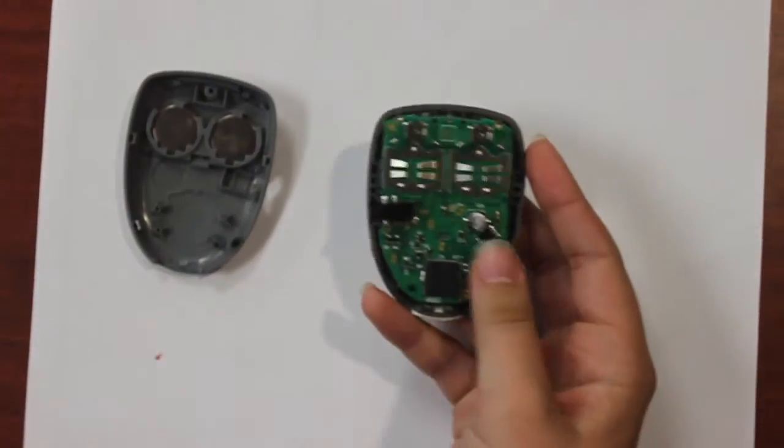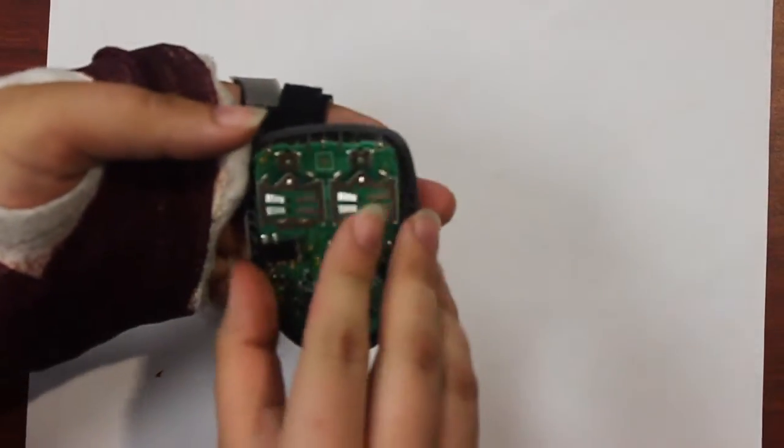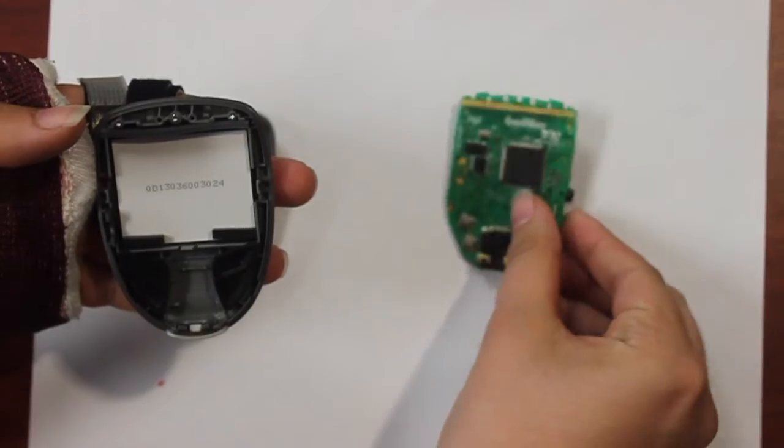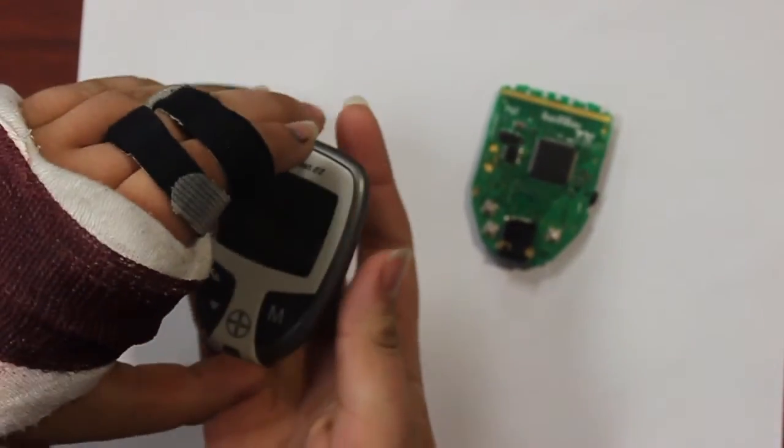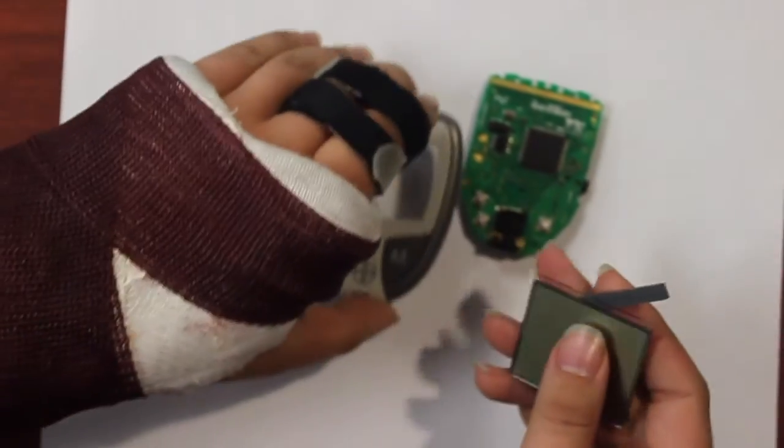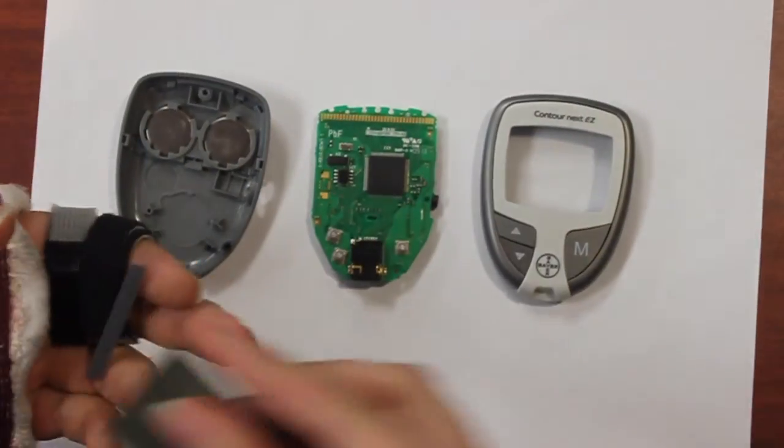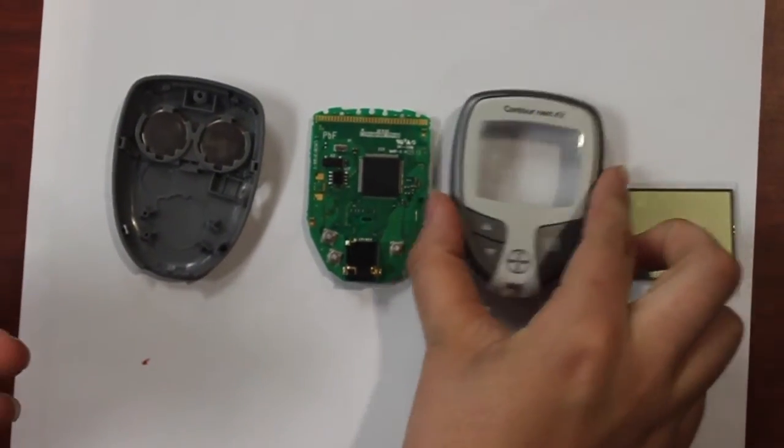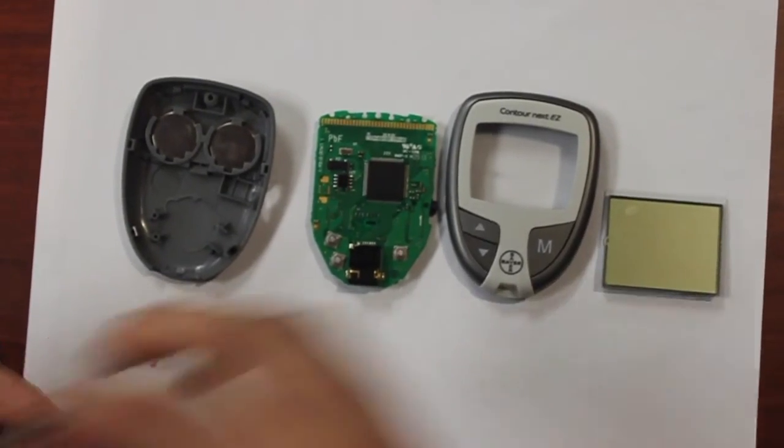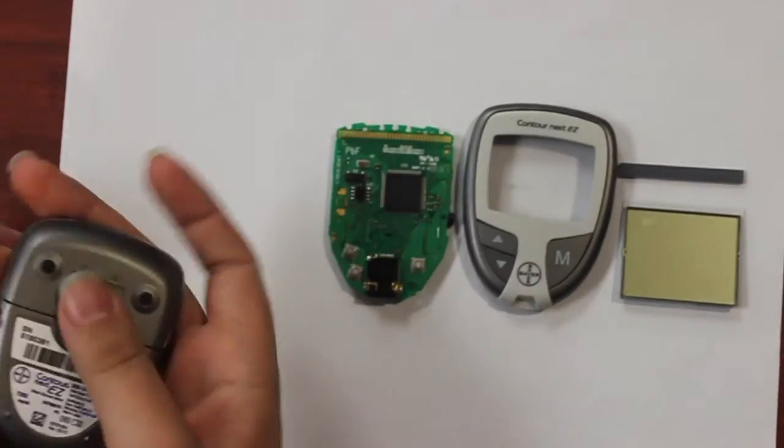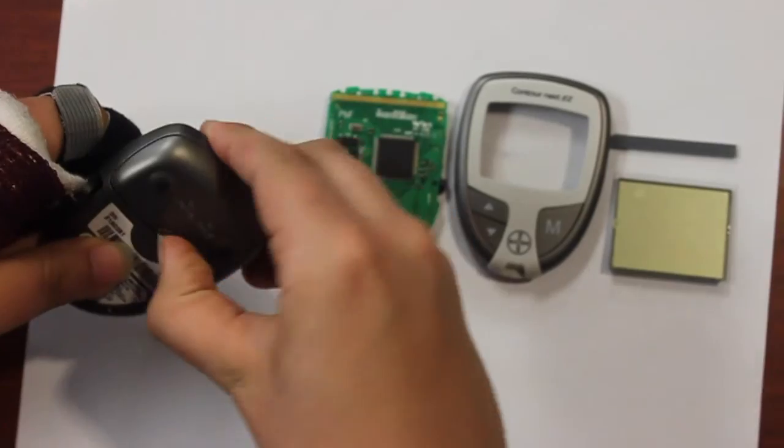Inside is a motherboard. On the other side of the motherboard is the LCD screen that displays the results. Attached to the LCD screen is a small conductor. On the back casing, covered by a little cover, are the two batteries.